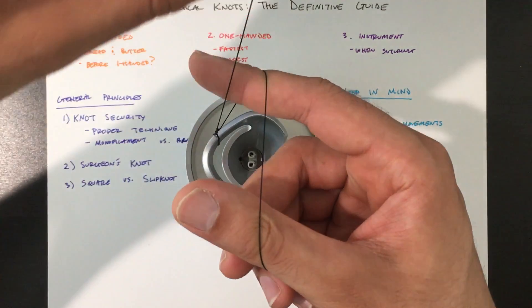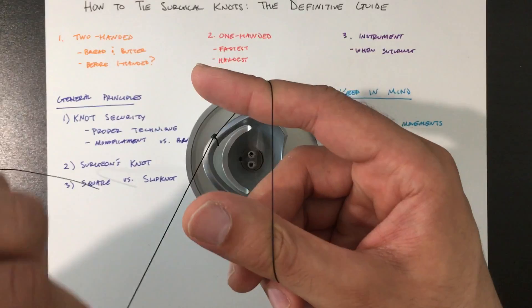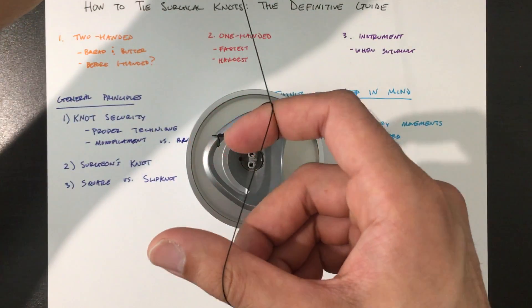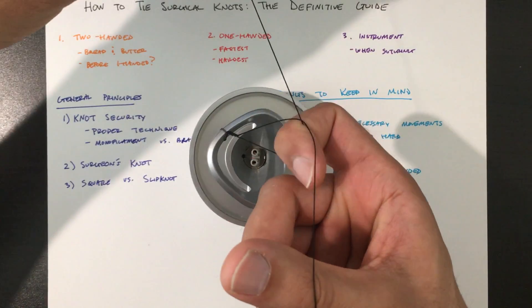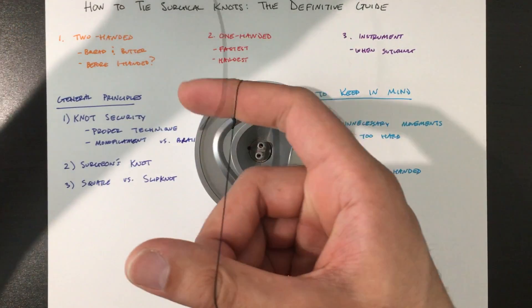Take the opposite side. Again, wrap it in the opposite direction. And this is the hard part of the one-handed tie. You want to take your index finger and bring this side through the loop.